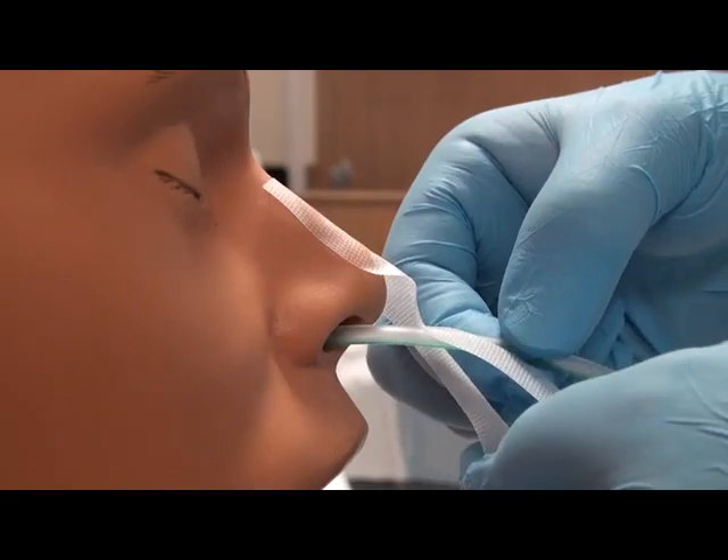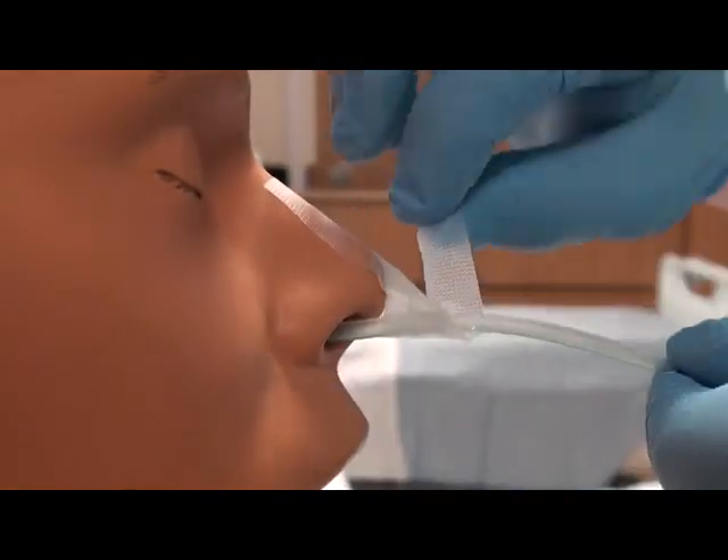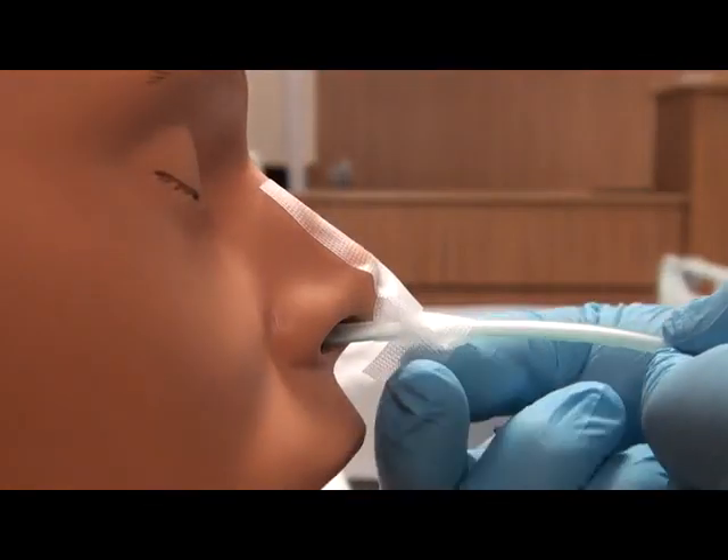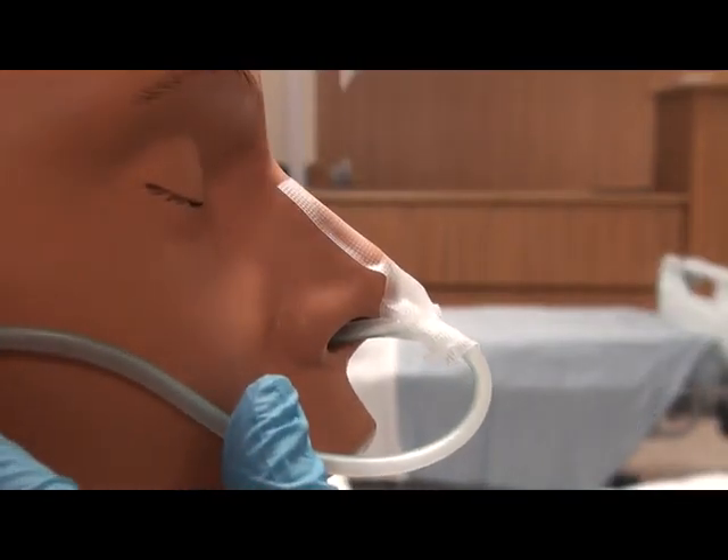Then secure the tubing according to your organisation's policy. Use adhesive tapes to ensure that the tube is stable and not removed.